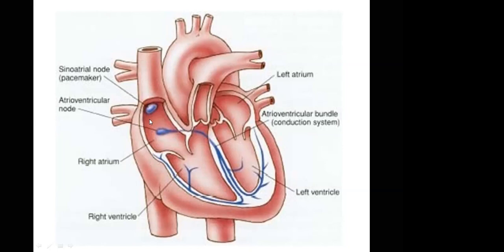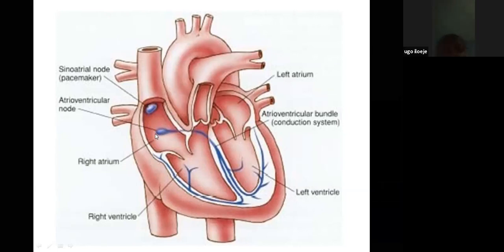Sinus cycle length simply means that if I put a catheter in the right atrium and I stimulate the right atrium by pacing it myself, not waiting for SA node function, it's going to transmit electrical activity to the AV node and other conducting fibers. Then I pace it again, and I wait for another electrical cardiac cycle to occur. I pace it again. So the time interval between the first pacing of my catheter in the atrium and the next time I pace it again: I paced it the first time, electrical activity was passed down to the ventricles. I paced it the second time, electrical activity was passed down to the ventricles. I paced it the third time, electrical activity.